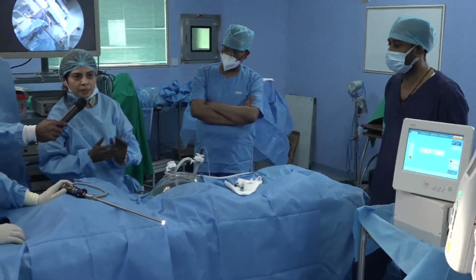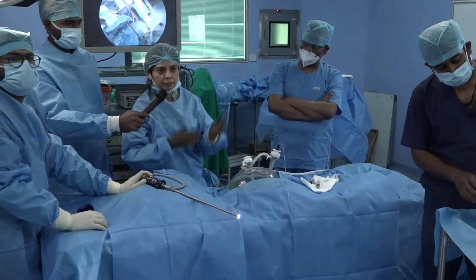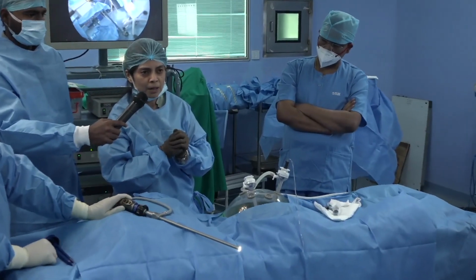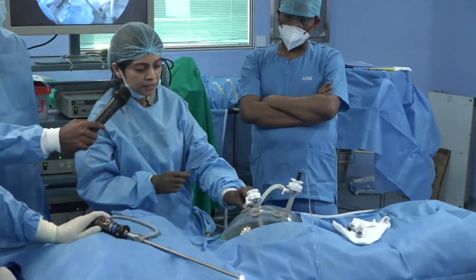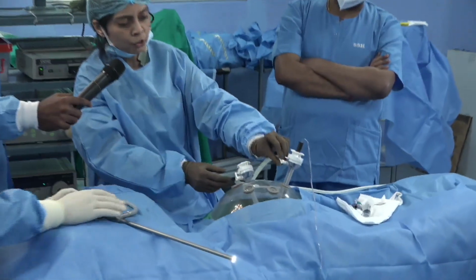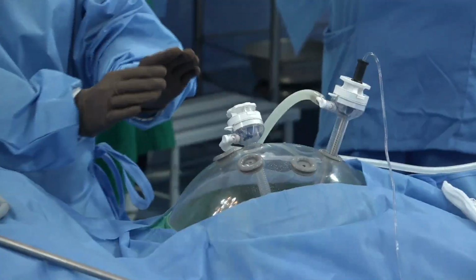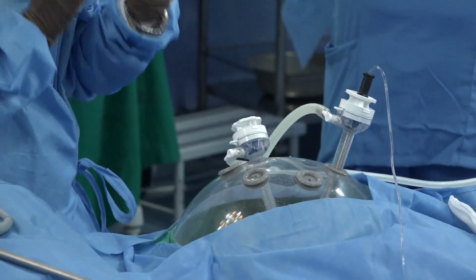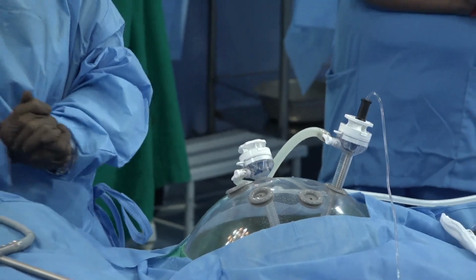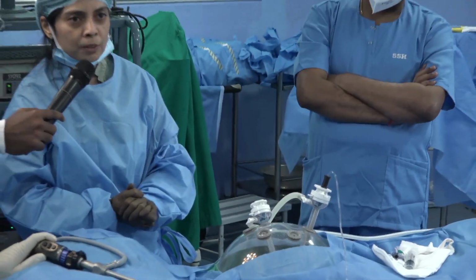Once 45 minutes are over, one of the OT staff will enter with full get-up, complete protection, masks and everything, come inside the theater, stop the CO2 insufflation, and open this exhaust valve. So everything gets slowly evacuated in a closed circuit. And then the rest of the team enters the theater and does the disposal and removal of the trocars.